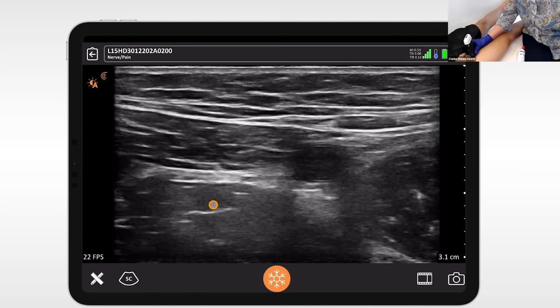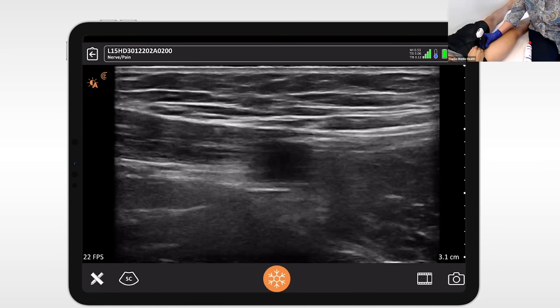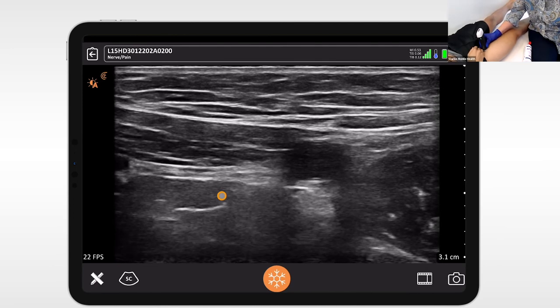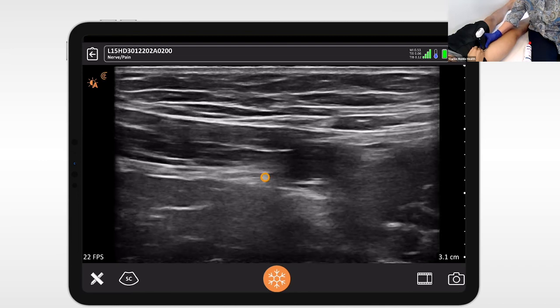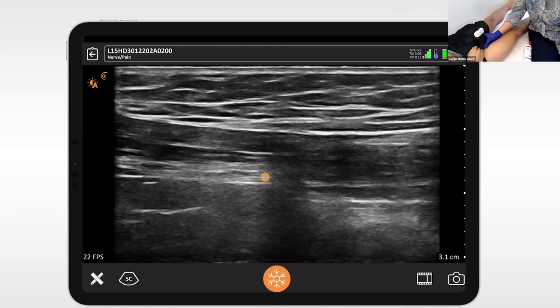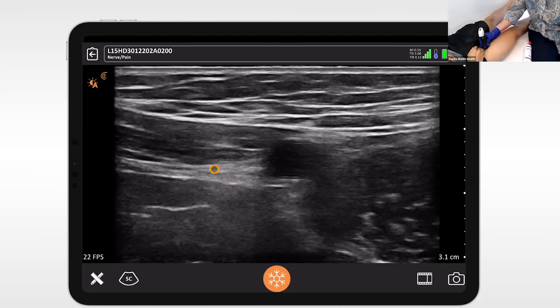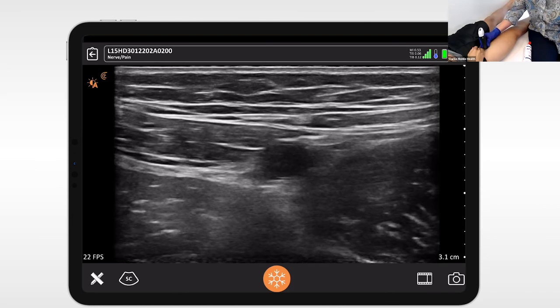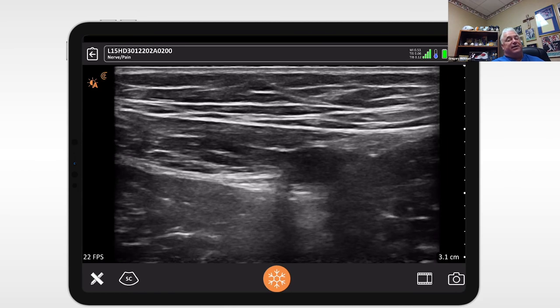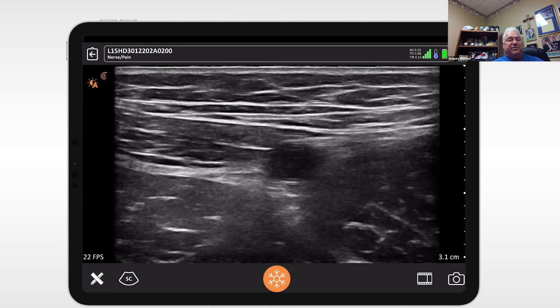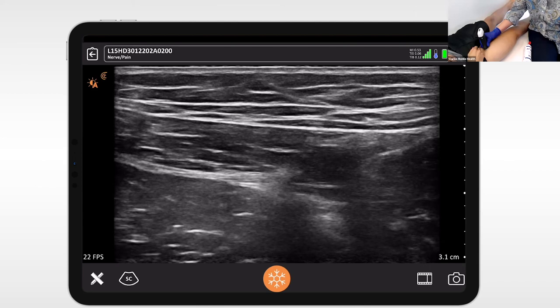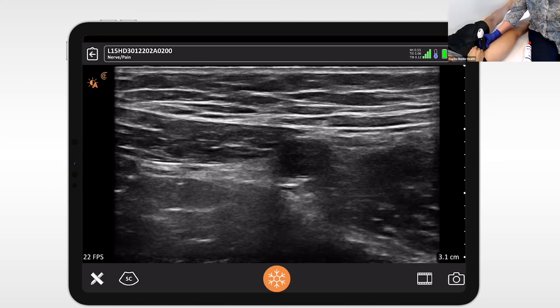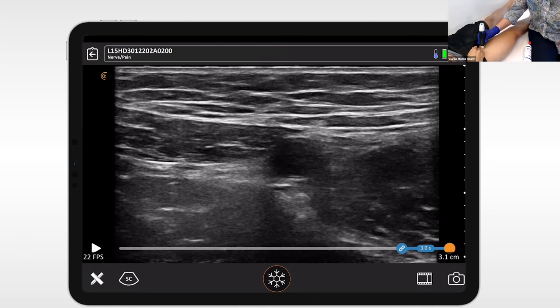You want to put the needle right in there between those two nerves. Rotate the scanner a little oblique so the catheter can go down the leg. If you oblique it too much more, you're seeing the vessel in long axis. You could essentially watch the catheter thread — that would be impressive, on a slow day when you've got lots of time.